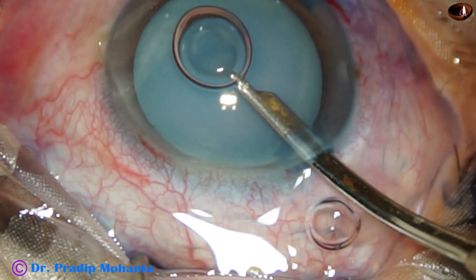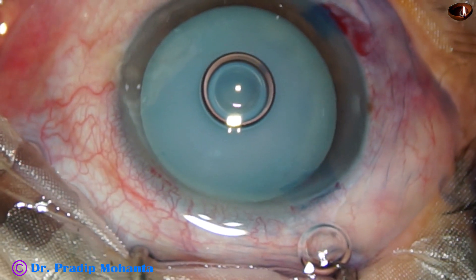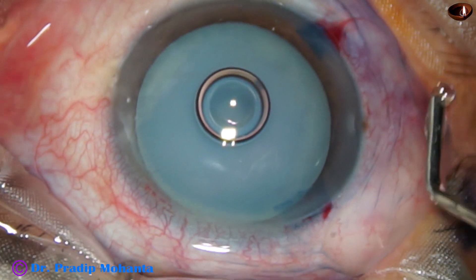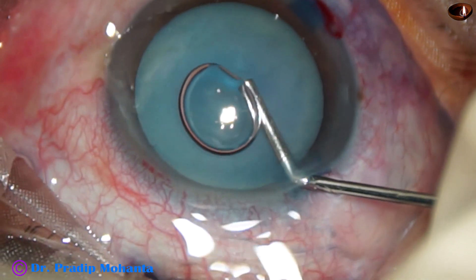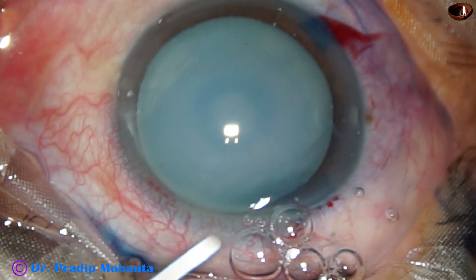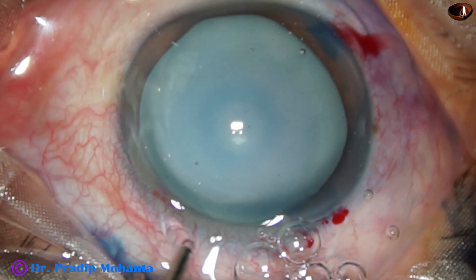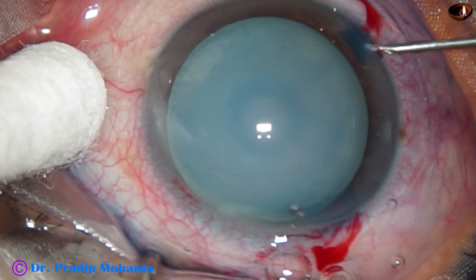The dye is not diluted by the aqueous and the staining is very quick. The dye is then washed out with BSS and then 2% hydroxypropylmethylcellulose is used to fill the anterior chamber. The visco is also applied over the corneal epithelium for better visibility. And now is the time to do capsulorhexis.